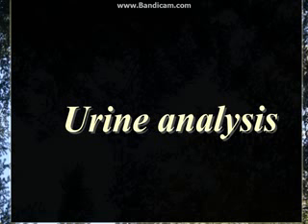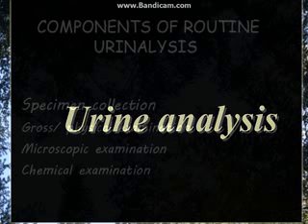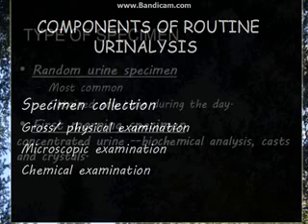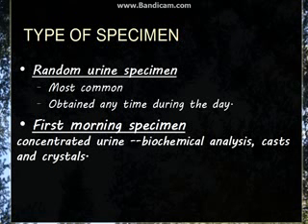Hello everyone. Today we will discuss urine examination. The examination will be discussed under the following headings: the specimen collection, and the gross, microscopic and chemical examination. Going to the specimen collection.